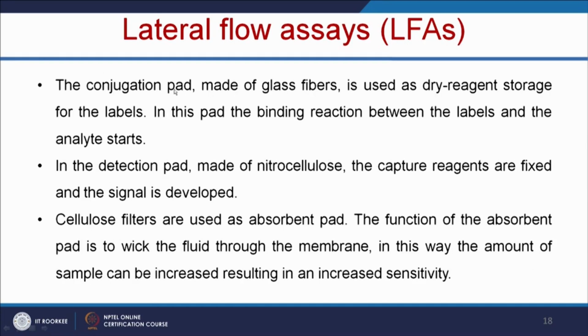And the next one is the conjugation pad. It is made up of glass fibers, and it is used as a dry reagent storage for the labels, and in this pad the binding reaction between the labels and the analyte starts.